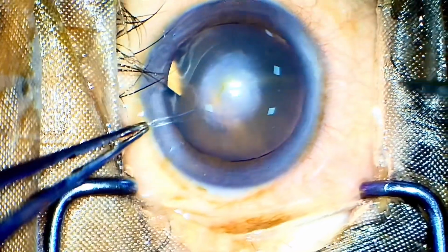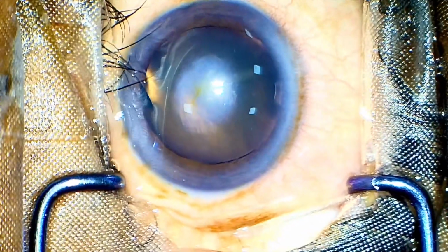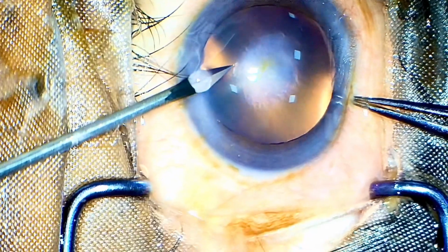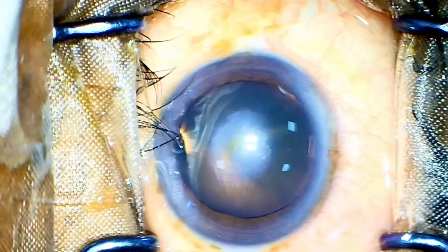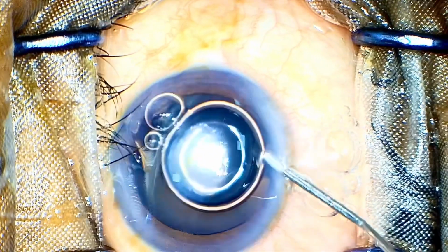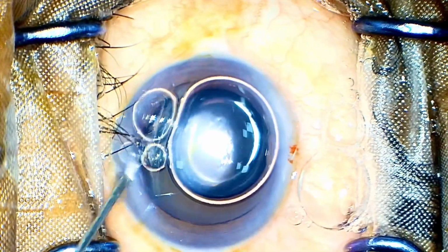So let's talk about this easy case today. This is a male patient with a central corneal opacity with around 8 diopters of myopia. He came to me with one request: doctor, please remove my glasses and give me some clarity. He had a presenting vision of counting fingers at 2 meters, unaided, and as soon as we gave him 8 diopters of myopic correction, his vision got to 6/12, although it was not clear in the central axis, but still he requested me to get off his glasses.